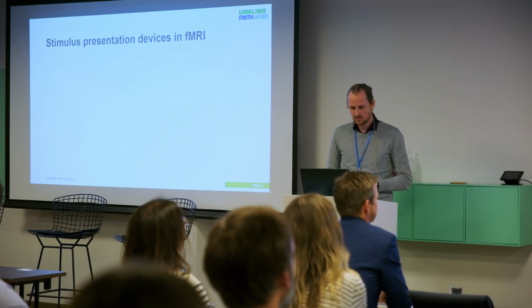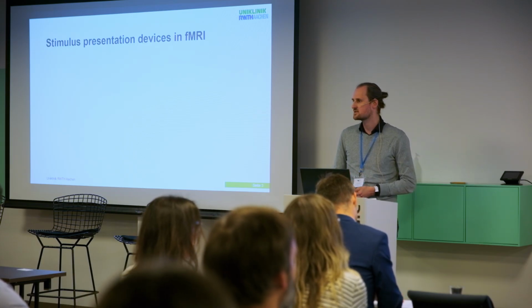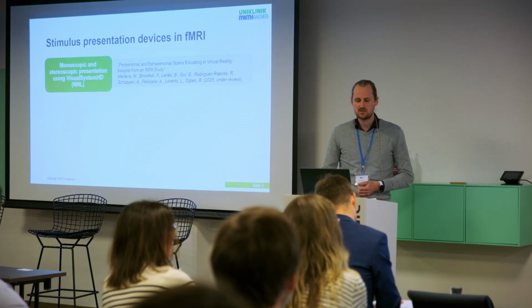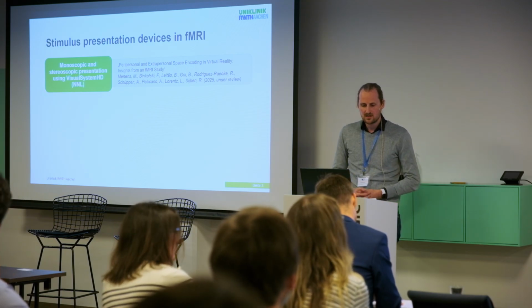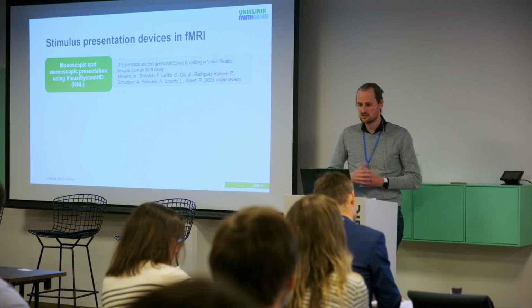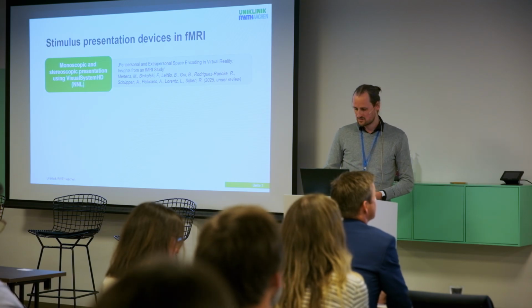So I would like to talk about 3 different studies shortly. Each of them uses different devices to present stimuli in the fMRI environment. The first one uses the Visual System HD, which you can see in the back, and it's used to present monoscopic and stereoscopic images. The study was conducted by a medical doctorate of ours, Merit Mertens.